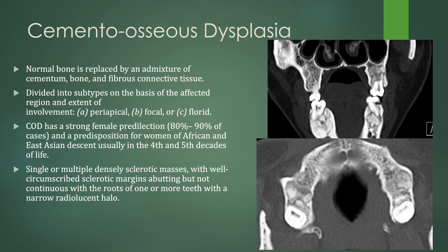Cementoosseous dysplasia: the normal bone is replaced by a mixture of cementum, bone, and fibrous connective tissue. These are divided into subtypes and can be periapical, focal, or florid. There is a strong female predilection and a predisposition for women of African and East Asian descent, tending to present in the fourth and fifth decades of life. They can be single or multiple densely sclerotic masses with well-circumscribed sclerotic margins, abutting but not continuous with the roots of one or more teeth. Look for that radiolucent halo around central sclerosis.